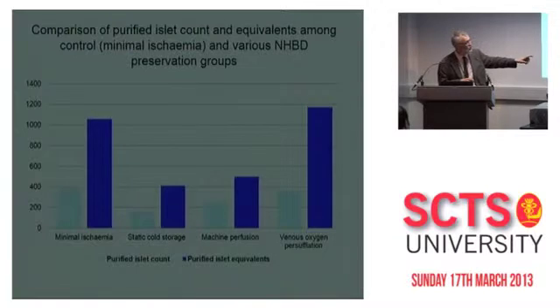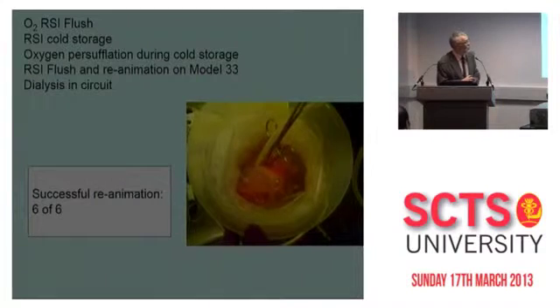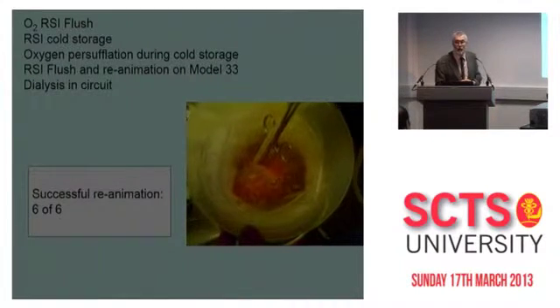If you go cold, if you have minimal ischemia, you have about 400 islets from a rat, and if you have warm ischemia and then cold static storage, you sort of knock that down to about 150, and you can actually improve it slightly with machine perfusion, but venous oxygen actually brings it back up to the minimal ischemia, so it's quite effective. So we thought we'd try this with the hearts.